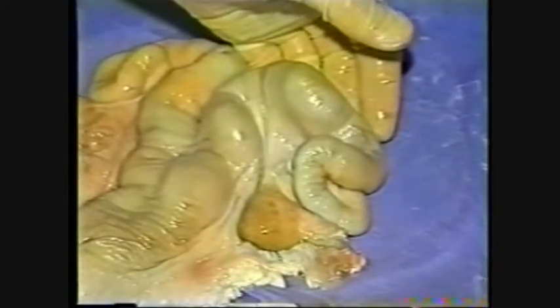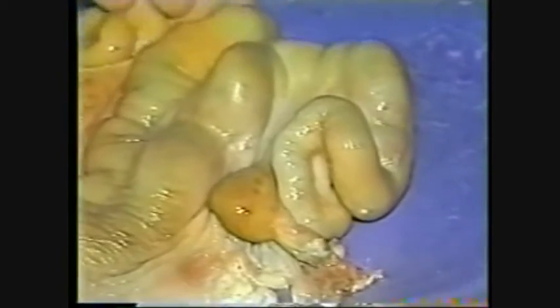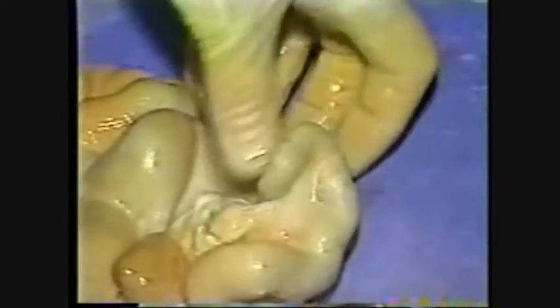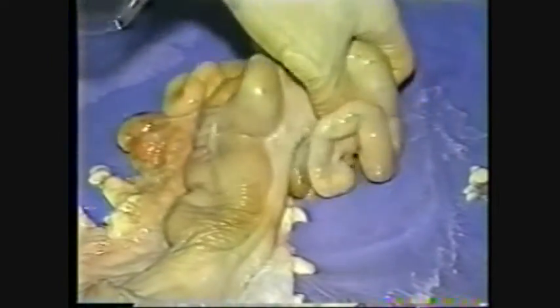Fluid comes in, it swells, the left horn is staying flat, flaccid and soft. The right horn is filling, it's nice and tight like a drum. You can easily palpate this when you're in the track. You can feel this real nice. Look how large this horn gets. You want to be sure you're getting clear down on the tip here.